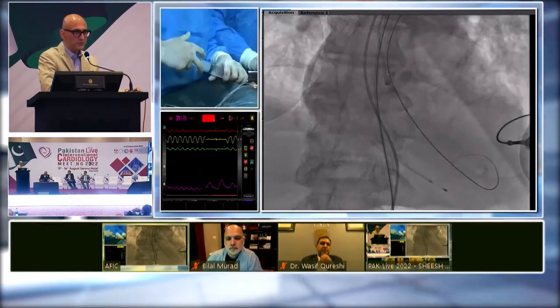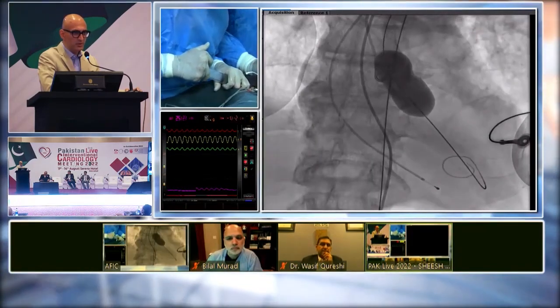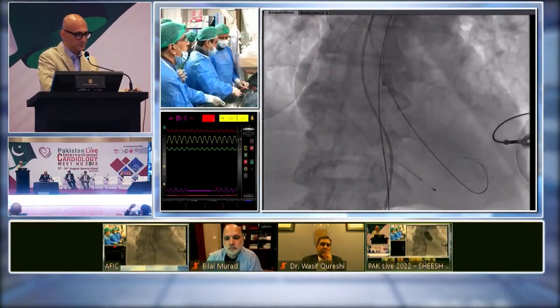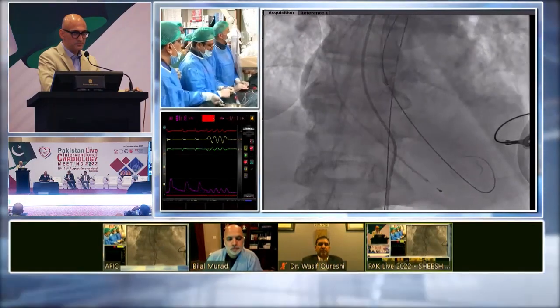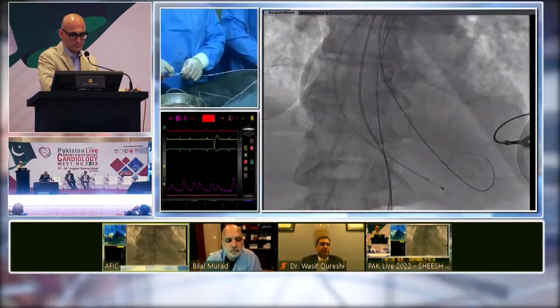Versus, if they have a right bundle already, and you're thinking that it's going to be a deeper implant, I usually put in a temporary wire. Yeah. Bilal, have you been, or Wasif, using a single side stick, one superiorly and one inferiorly, instead of going bilaterally?